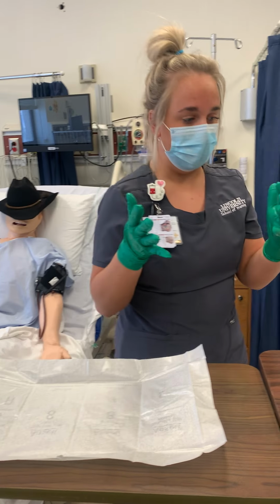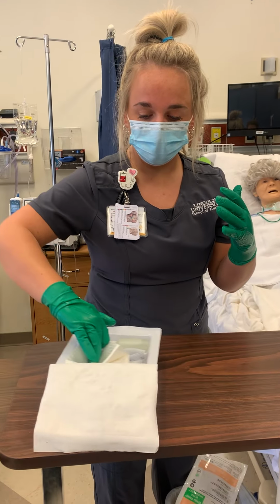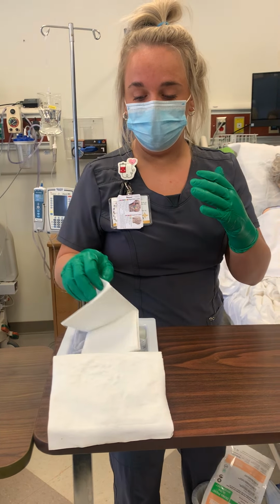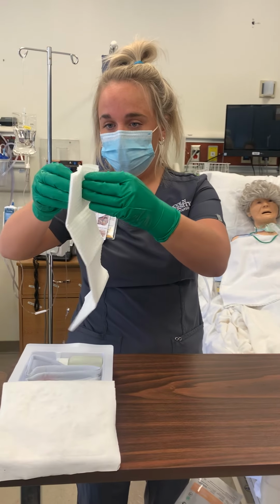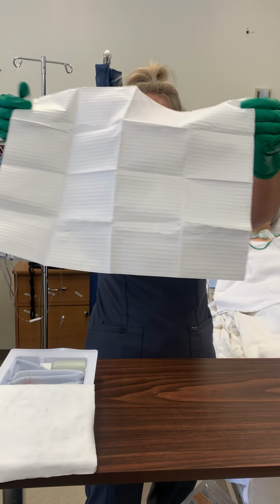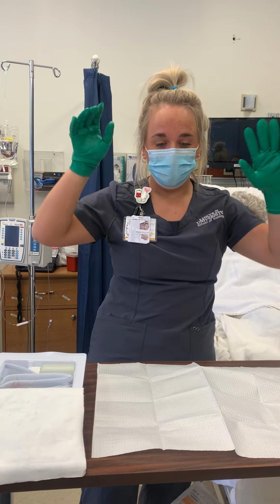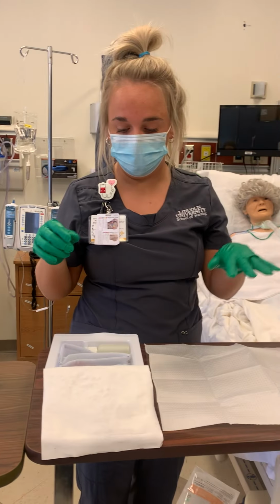Okay, so now that I'm sterile, I can come over here. I'm gonna get my sterile field ready, keeping it above my elbows. Okay, so now I can start adding stuff to the middle of it.